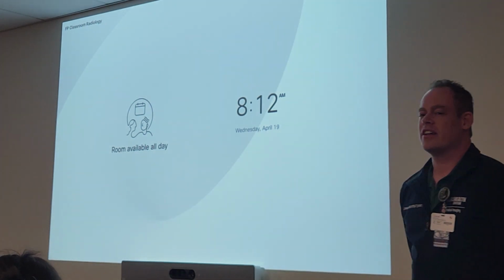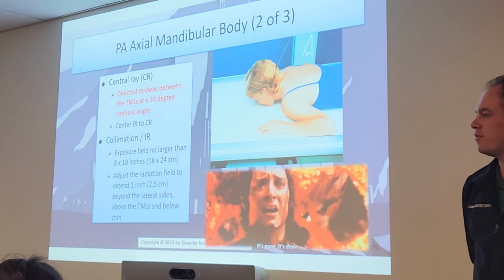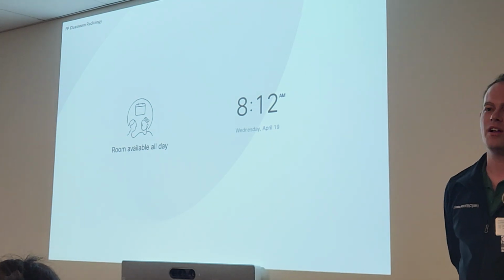Of course, make sure you utilize that good tight collimation again, guys. One of the mistakes people make on these mandibles, again, if we're talking about certain techs at the hospital, is they leave it wide open. We do not want that.